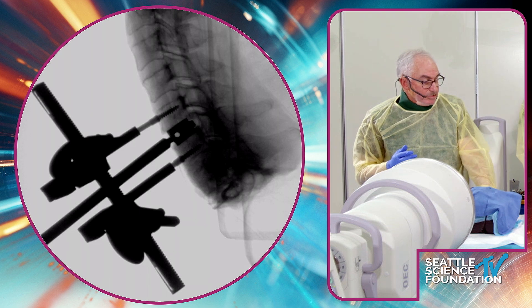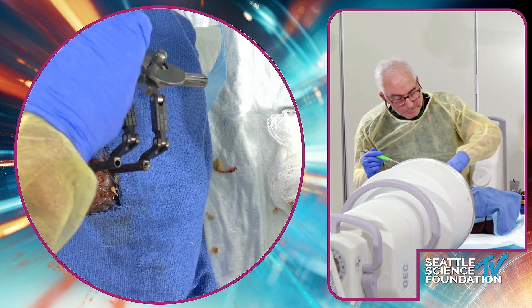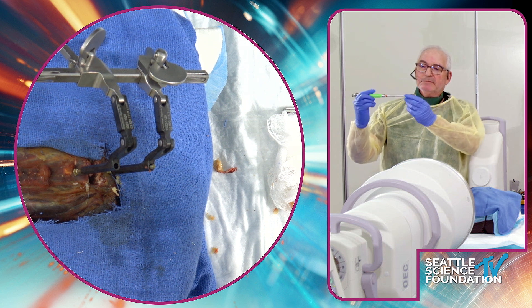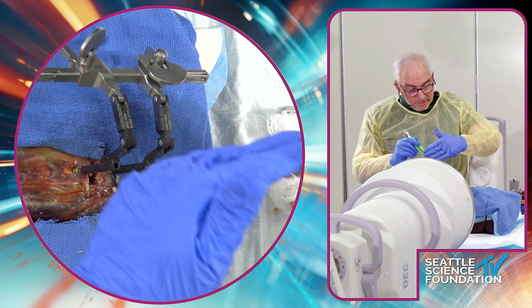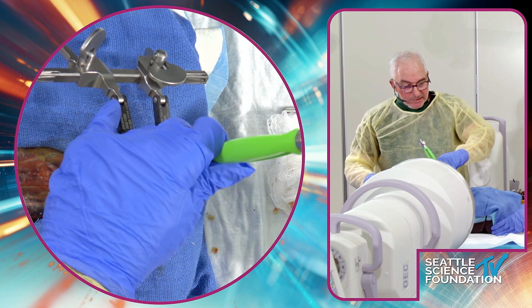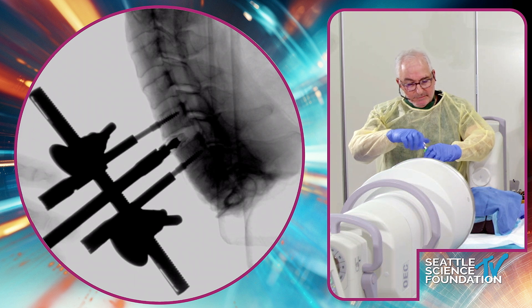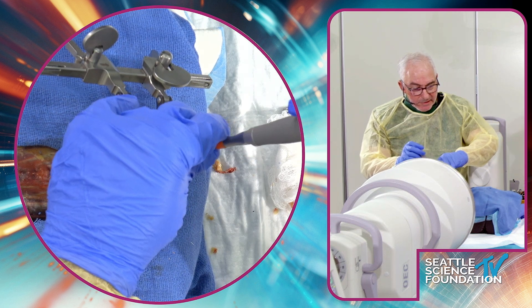Then we've got the prosthesis again. I'll usually distract a little bit again. The Simplify has three teeth on the front at the top, two at the bottom. I like to look at the dome — the dome always goes up. If you want a little extra lordosis, this has flat end plates but you can get more angled end plates with this implant. The trick is you get it in about a third to halfway and then remove the inserter for final insertion — and try not to push it into the canal.